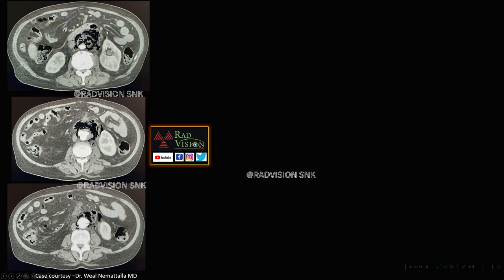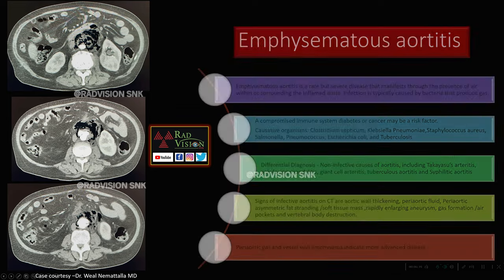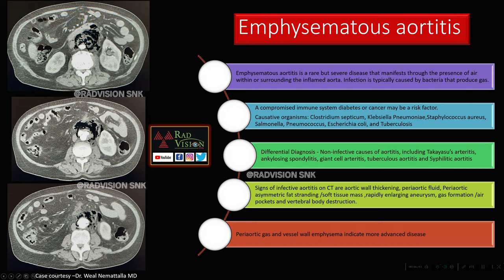Next case: here you can see the aorta with thickening of the aortic wall and an aneurysm arising from the right lateral aspect, surrounded by free air. Multiple free air pockets are seen surrounding the aorta. This is a case of emphysematous aortitis — defined as the presence of air or free air surrounding an inflamed aorta. The most common causative organisms are gas-producing bacteria such as Clostridium and Klebsiella.